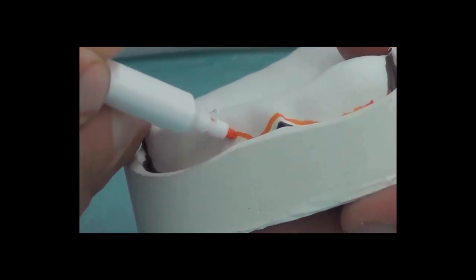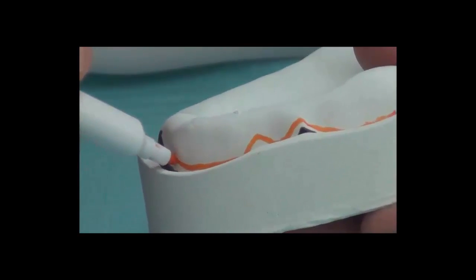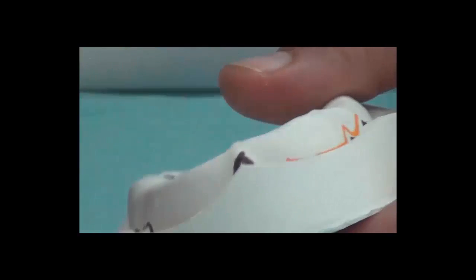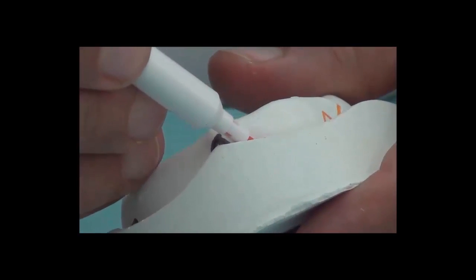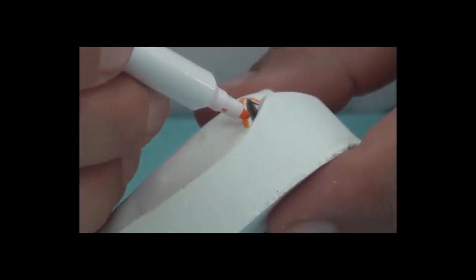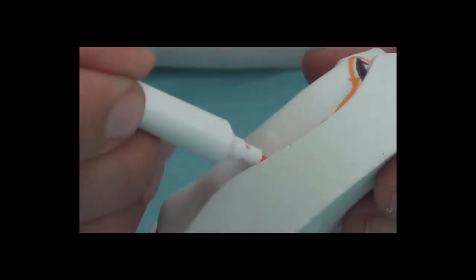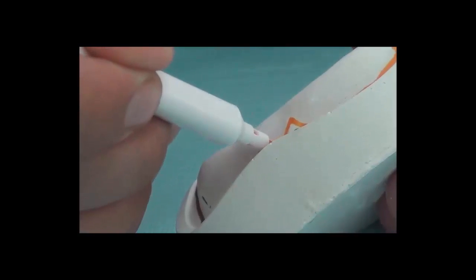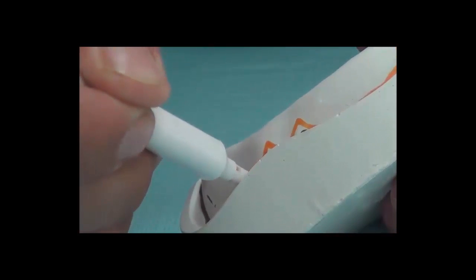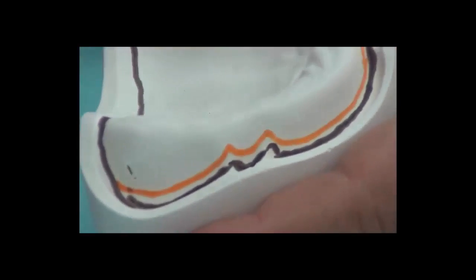So if on the freni area we have to make these notches, we follow on the labial area. We follow to the labial frenum, and once more allow clearance for the labial frenum. Run to the other side with the same features: freni, notches opposite to the freni in the tissue. I go behind until I reach the far end.